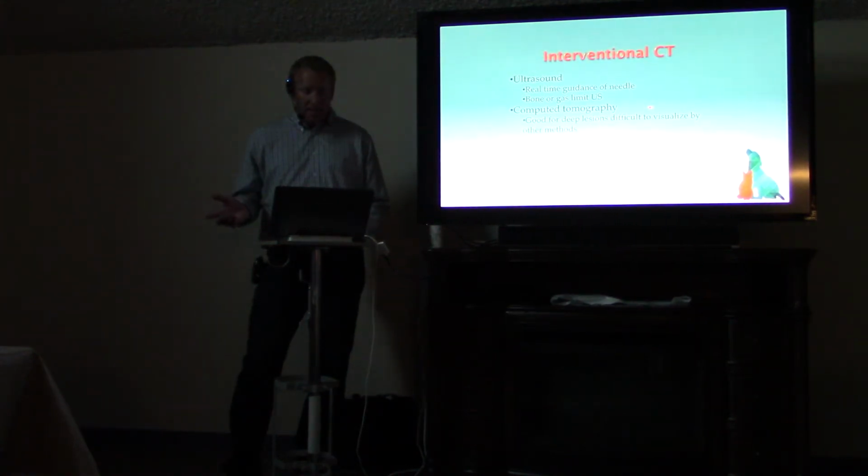The last thing that I'm going to talk about briefly is interventional CT. And when I say interventional CT, I mean the use of CT to do guided fine needle aspirates and biopsies. Ultrasound's the most common method of doing this. We're all familiar with getting ultrasound guided aspirates or biopsies, or even just using ultrasound to help get a cysto.